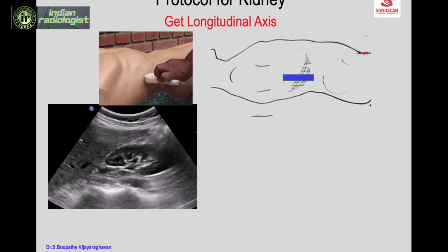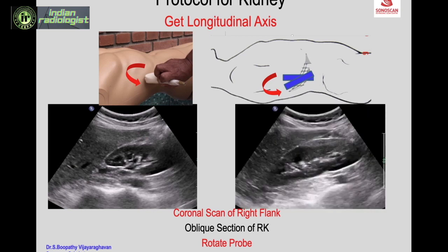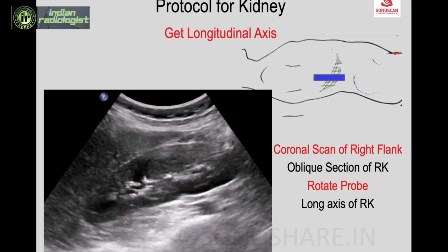To get the longitudinal axis of the kidney: when you attempt a coronal scan you initially get an oblique scan of the kidney. From there you rotate or swivel the probe to get the long axis of the kidney. If you swivel too far it becomes oblique again, so you come back to the longest axis. This is demonstrated in the video — oblique, then swivel to get the long axis.